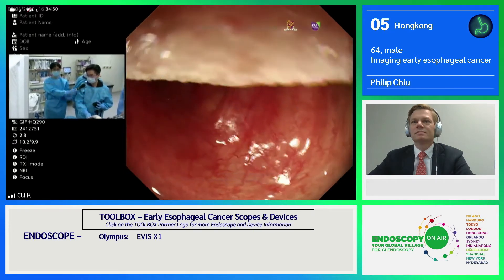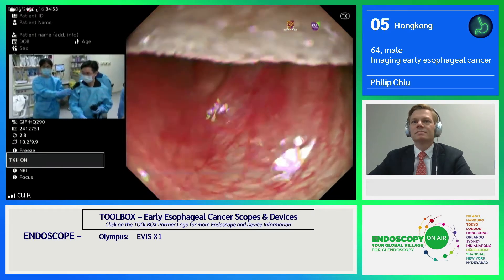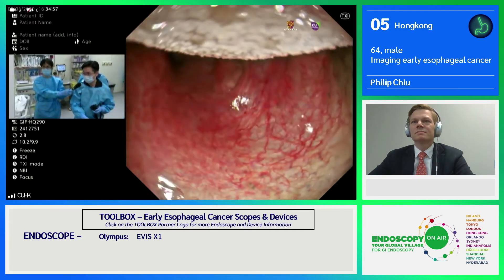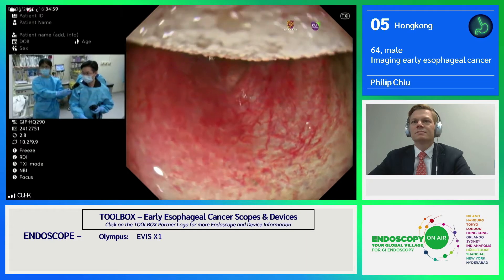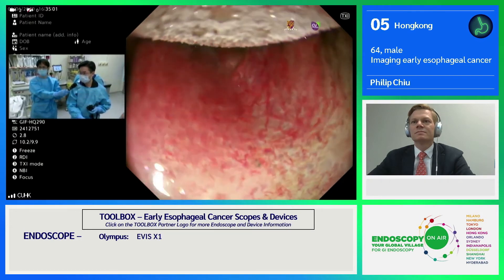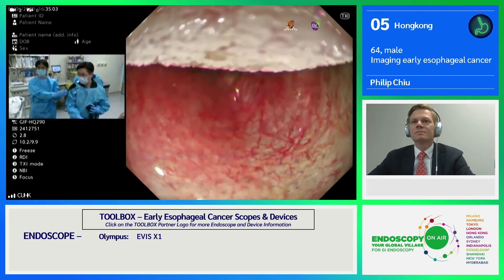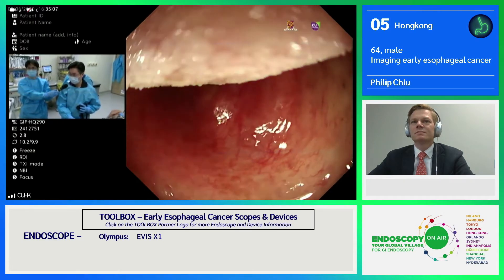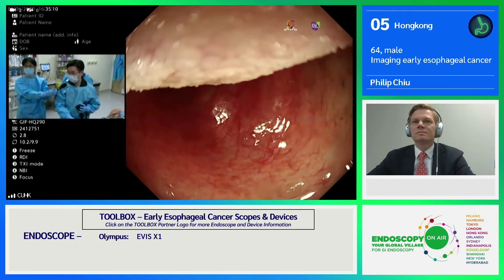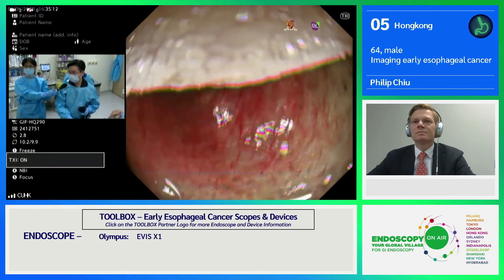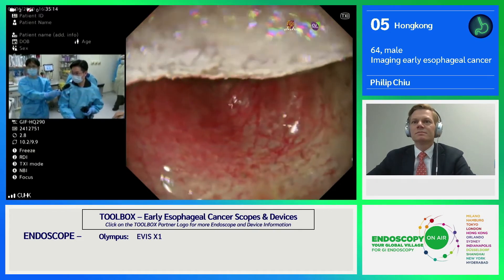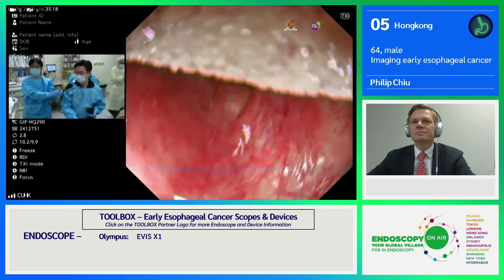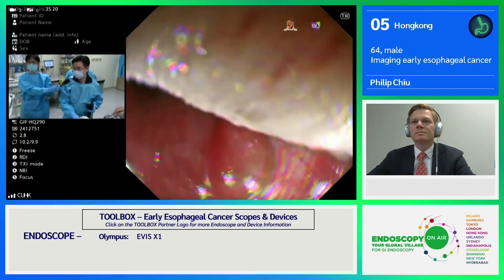This is the white light endoscopy mode. Now I'm changing to the TXI mode. This mode helps to enhance the background architecture. It has the advantage of detection for early lesions because, compared to ordinary white light, the background architecture and structural arrangement is much more enhanced, giving better visualization to help detect irregular or abnormal areas.